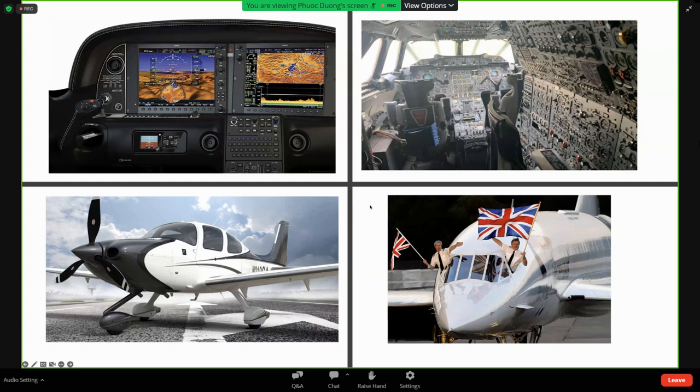However, in terms of the procedural planning, the usability, the friendliness, they are very different. With one there are a lot of panels, and the pictures or the controls look very similar. Whereas with the other, the easier technology allows you to plan your routes out, with a lot of automation and lots of colorful guidance.